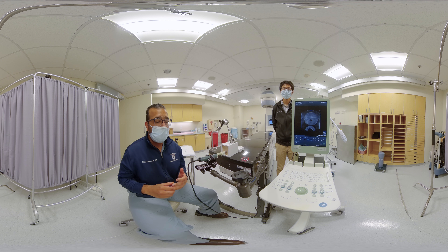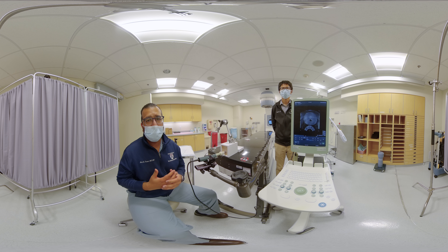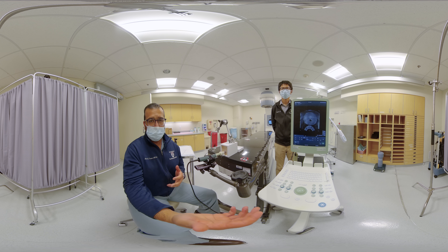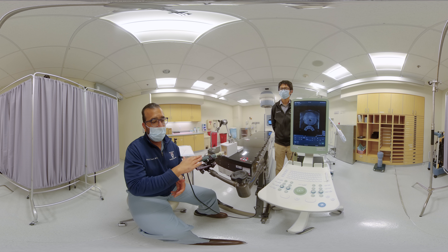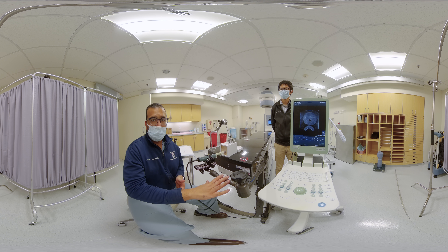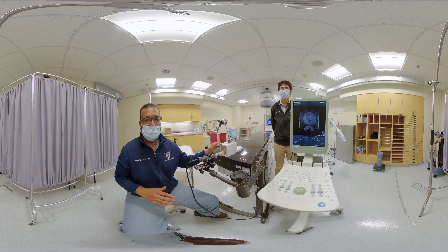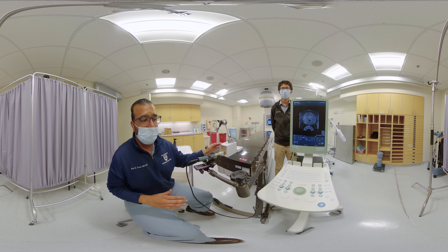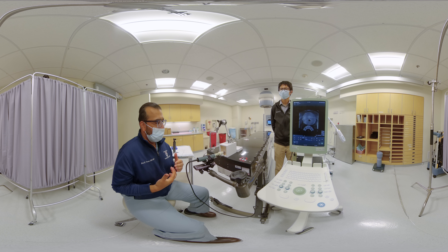This will be particularly useful for practitioners interested in freehand transperineal approaches. Today's demonstration uses generally widely available tools. To our side is a BK-Flex Focus 400 ultrasound with a biplane side-fire probe, a CIVCO workstation/stepper, simulated inanimate models prostate phantom, a 17-gauge CIVCO gold fiducial marker which is unloaded for this demonstration, and a CIVCO condom cover on the probe.